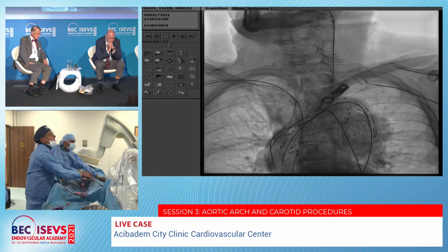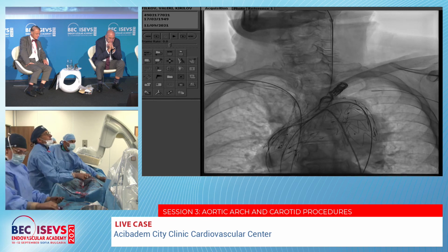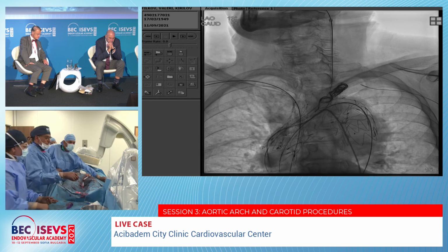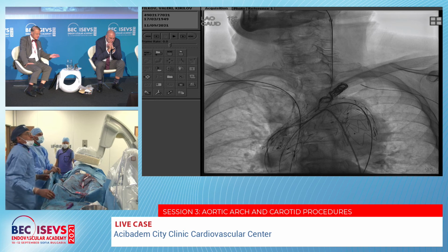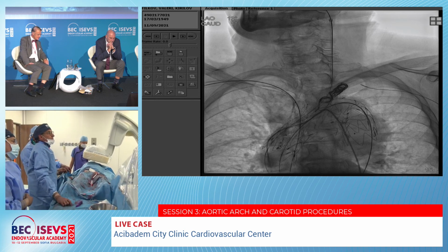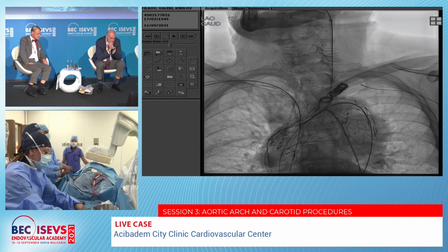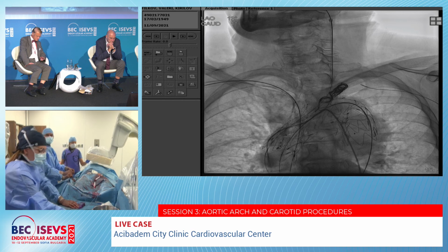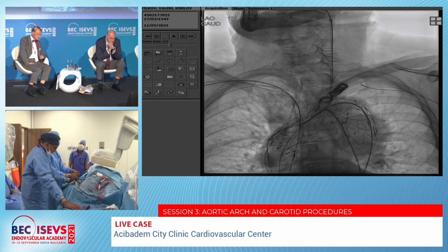Okay, and they're in place, you see, they don't move distally, so it's absolutely fine. And it's no problem, even when it's not occluding. That can be done in a couple of weeks. What I wanted to comment is that in fact we can make a second step, an occluder, without any problem.